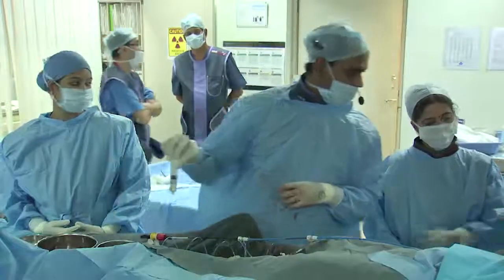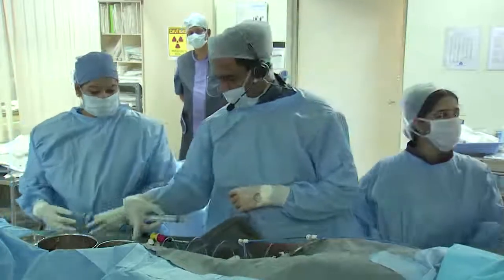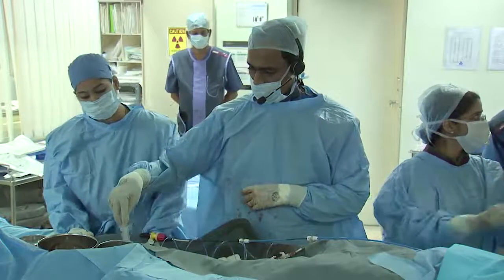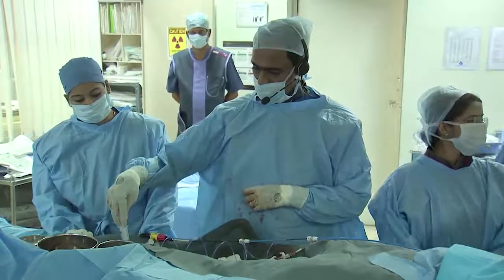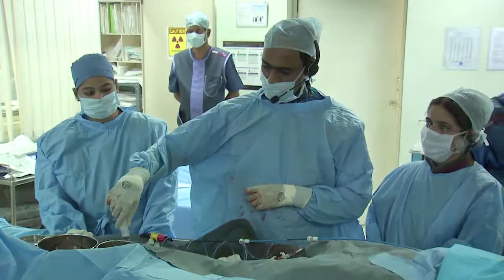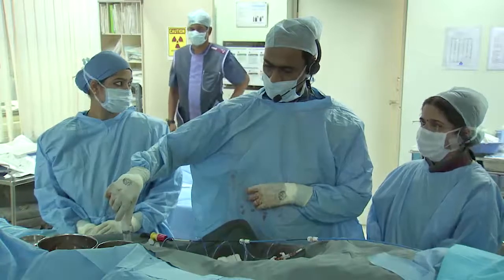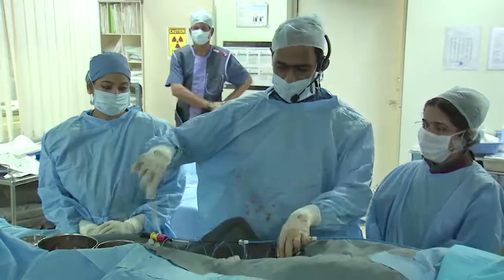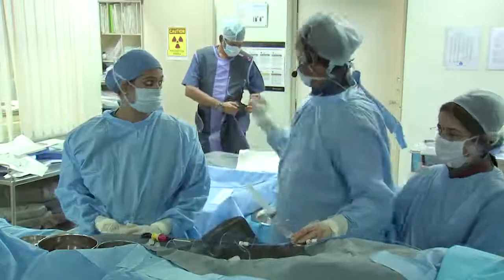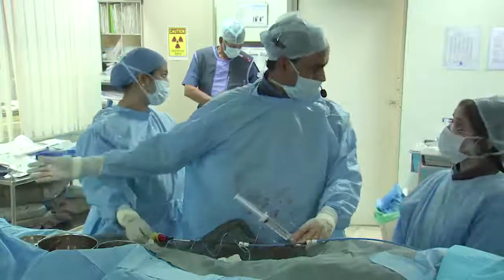This is Nick again. We had this device placed in patients on a compassionate care basis, and we had one patient with left heart problems, and we implanted this around about a year ago. This patient finally ended up having a cardiac transplant as planned, and when the heart was taken out 1 year later, we had the chance to have a look at this device 1 year after implantation. It was a 6 millimeter device, or a device with a 6 millimeter hole, and there was ingrowth.